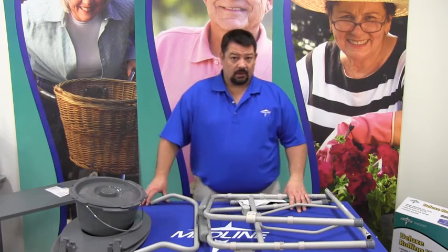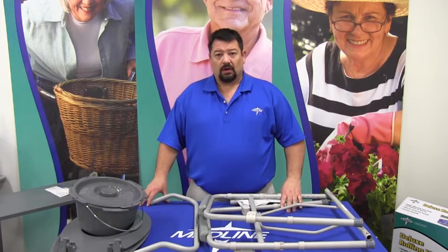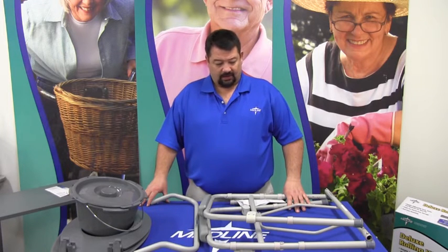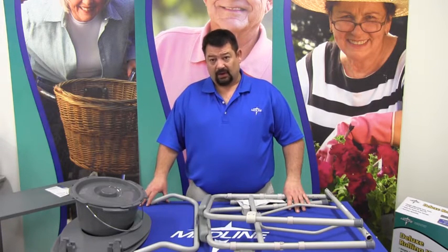Hi. This instruction is on commodes. Commodes are portable toilets. They come in standard, pediatric, and bariatric.